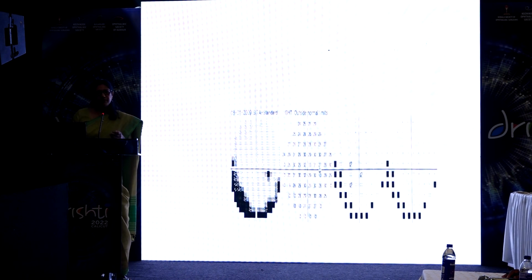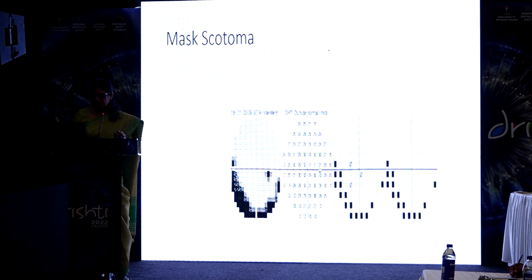So this was a field defect that was increasingly being seen the last couple of years when we used to do the test with the mask on. So it's either due to the mask or due to the breath fogging the lens, or sometimes the mask is put so tight that the tissues beneath the lower lid are bunched up, and they can cause a field effect like this. So this we can call a mask scotoma.